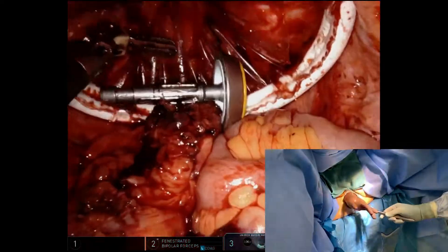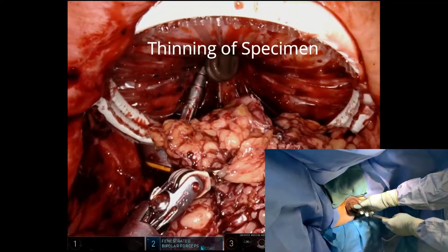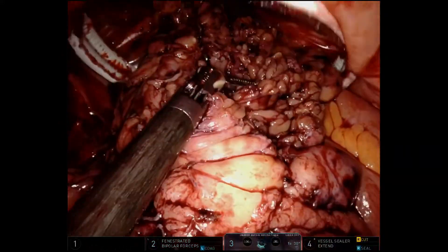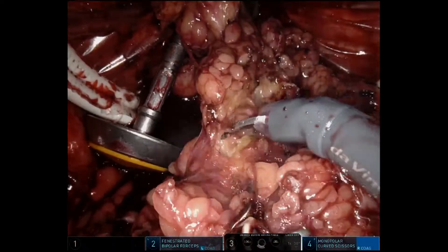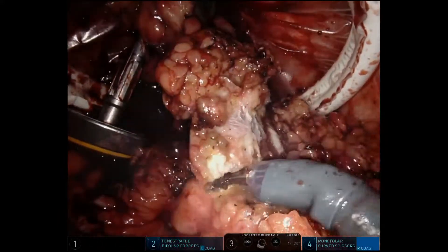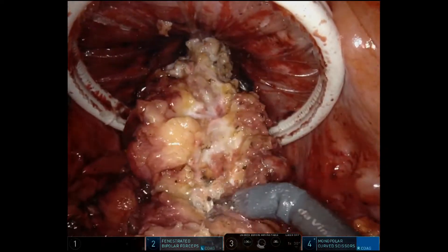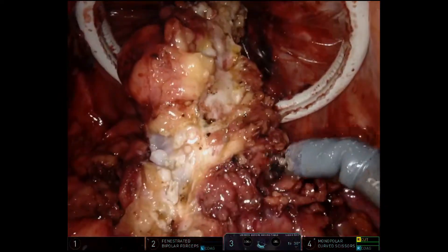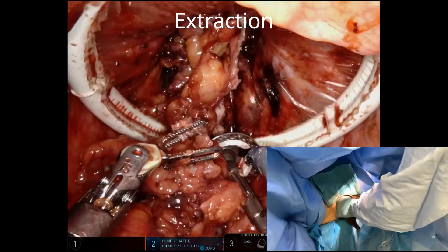There we're pushing in the anvil in preparation for our anastomosis. Here we're going to extract the specimen, but with bulky disease we need to thin it. We grab it through the rectum — you see the glove there on the ring forceps. We're grabbing it through the assist port for traction-countertraction, and using a monopolar scissor, we're readily able to shave off the mesentery from the undersurface of the bowel. Of course, this would only be done in benign cases — we're not going to shave the mesentery on a malignancy. With gentle traction-countertraction, the specimen comes out readily without any tearing.